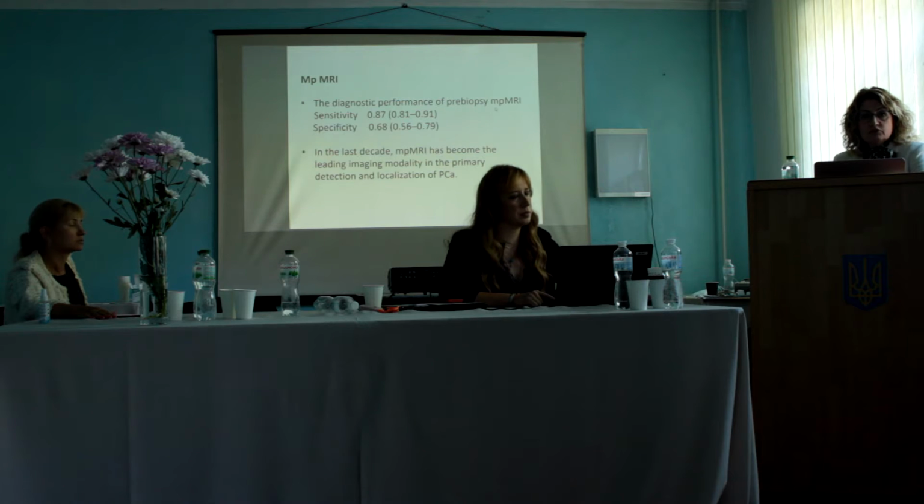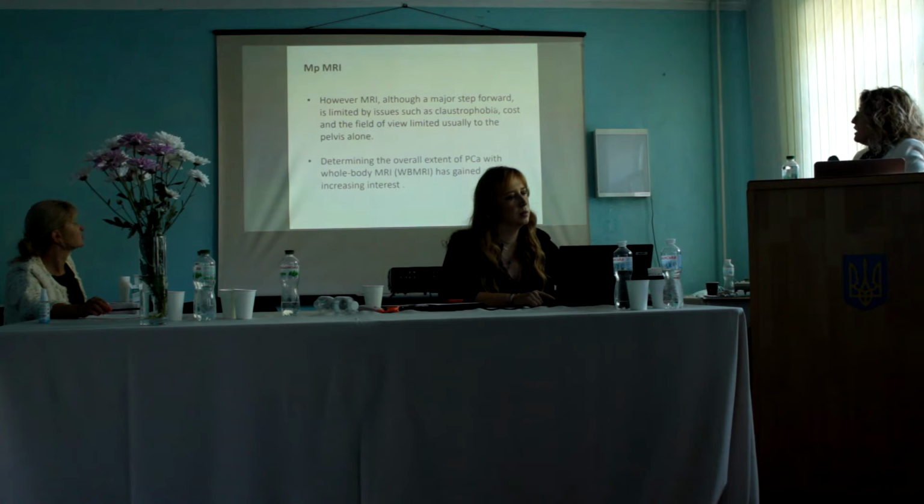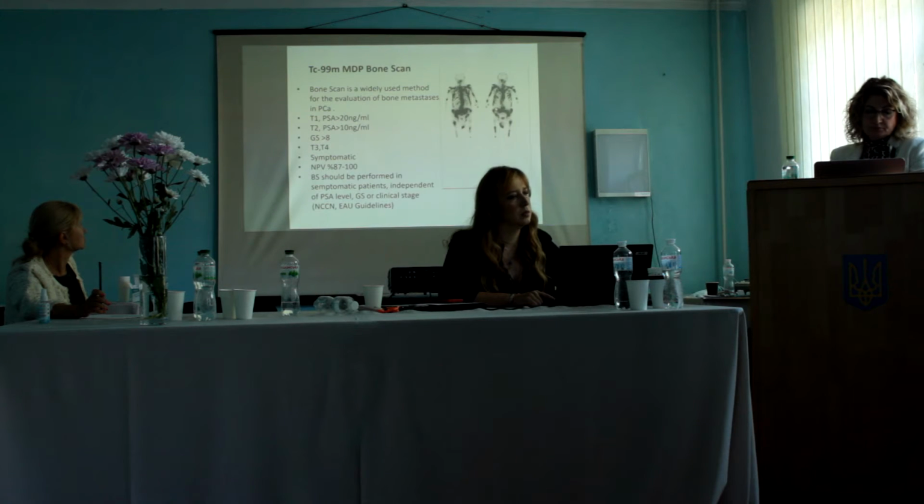In the last decade, multiparametric MRI has become the leading imaging modality in the primary detection and localization of prostate cancer. However, MRI, a major step forward, is limited by issues such as claustrophobia, cost, and a field of view usually limited to the pelvis alone. Determining the overall extent of prostate cancer with whole-body MRI has gained increasing interest.